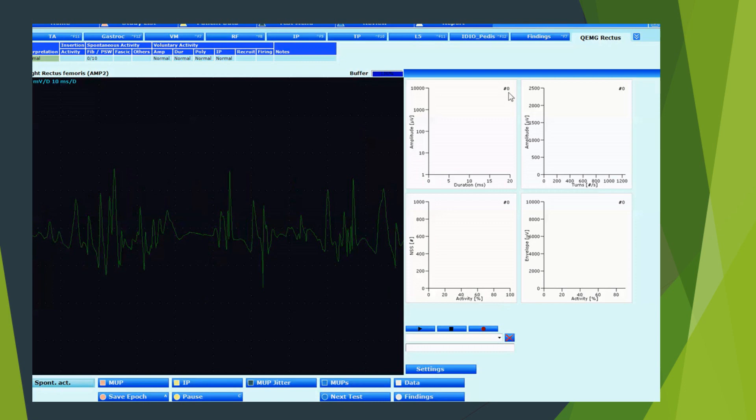As you can see, one's having a very rapid recruitment of the interference pattern here with these very polyphasic and relatively low amplitude motor units.